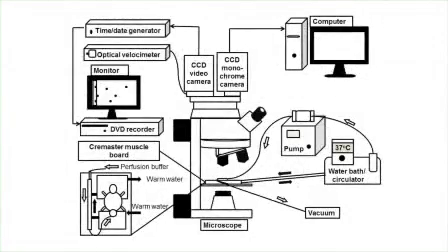The overall goal of this protocol is to use brightfield intravital microscopy and time-lapse video photography to study dynamic neutrophil-endothelial cell interactions during neutrophil recruitment in response to neutrophil chemoattractant in vivo. In this video, we demonstrate the procedures of how to use brightfield intravital video microscopy to visualize and determine neutrophil intraluminal crawling, transendothelial migration, and chemotaxis in cremaster muscle tissue in the mouse.